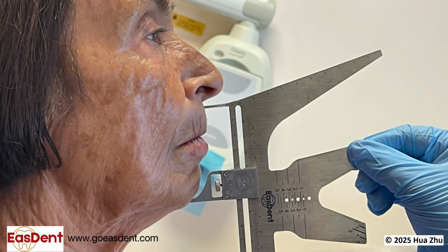You can verify VDO with the patient's VDR by measuring from the lower border of the septum of the nose to the lower border of the chin when the patient is at rest. The outer edge of the shorter stick should be 4 mm from the nose at rest. This 4 mm includes the 2 mm you leave for the actual final impression thickness and 2 mm of freeway space.